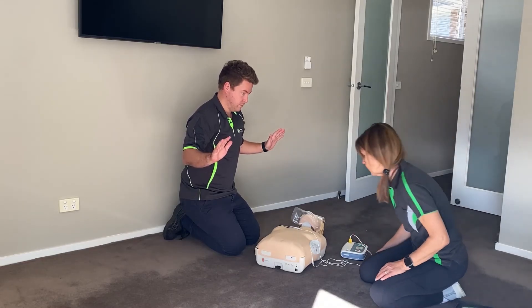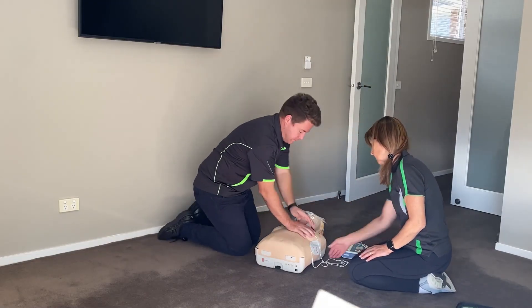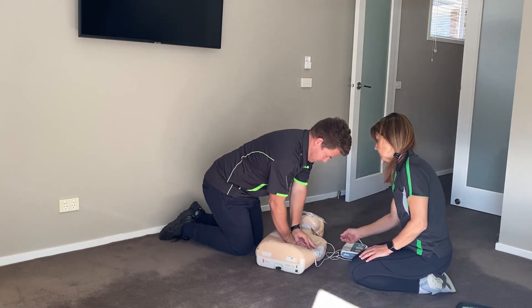It is safe to touch the patient. Continue CPR. Start CPR. This takes around two minutes before the AED reassesses.